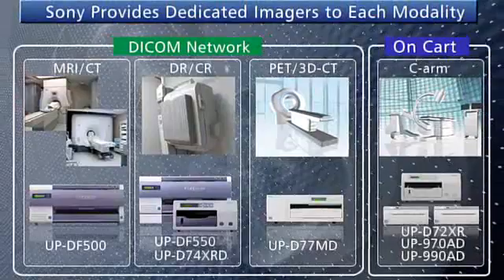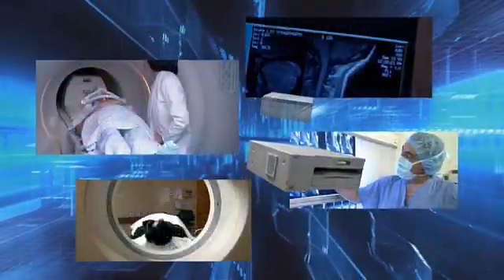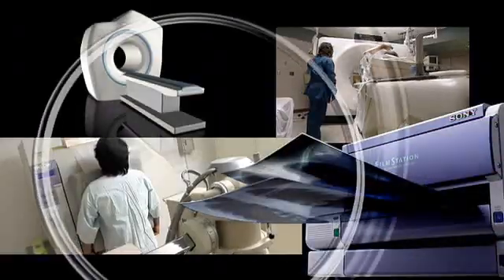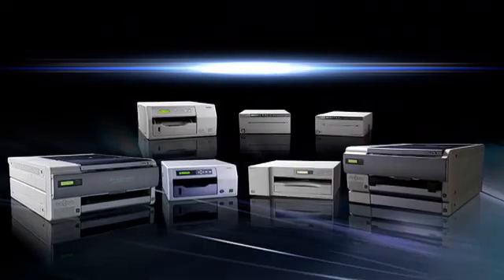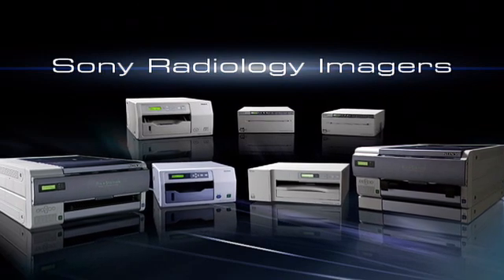Sony medical printers are designed to fit each type of modality, providing a high quality printing solution for a range of medical professionals. With its wide range of printers and its accomplishments in diagnostic image technology for ultrasound and endoscopy, Sony is aggressively advancing into the diagnostic radiology device field.